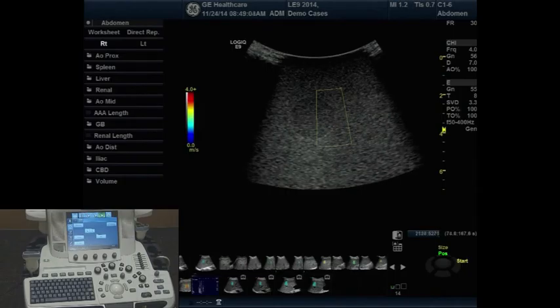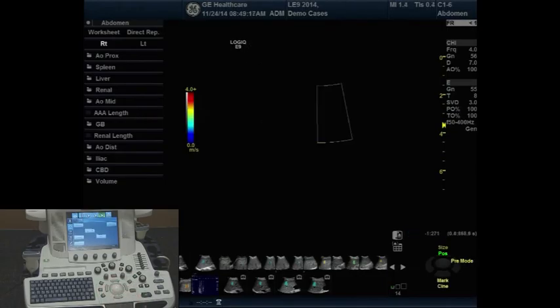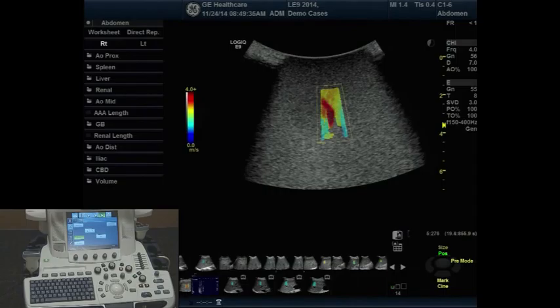Now to enter the true shear wave elastography mode, you're going to want to use the right mouse button, which is labeled Start. So as soon as I hit the Start button, you'll see right away I have fill within the region of interest. Now since we are measuring within a phantom, there is a phantom button on the touch panel which I want to press so that I can optimize my settings just for measuring within a phantom. Obviously clinically that's not something that you'll normally use.